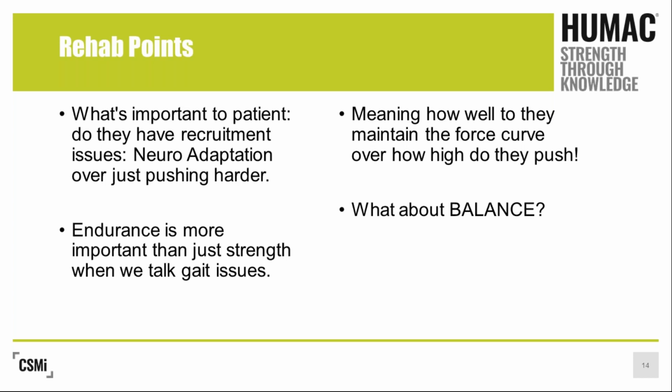And I know in the past we've brought most of our rehab training on this webinar back to ACLs and some of those others, but I really want to push the point that we all have significantly more osteoarthritis patients out there than we're ever going to have ACLs. So think how many patients we would be able to benefit from the treatment processes that we have if we could always reach them. So again, how well do they maintain that force? Over how high do they push?